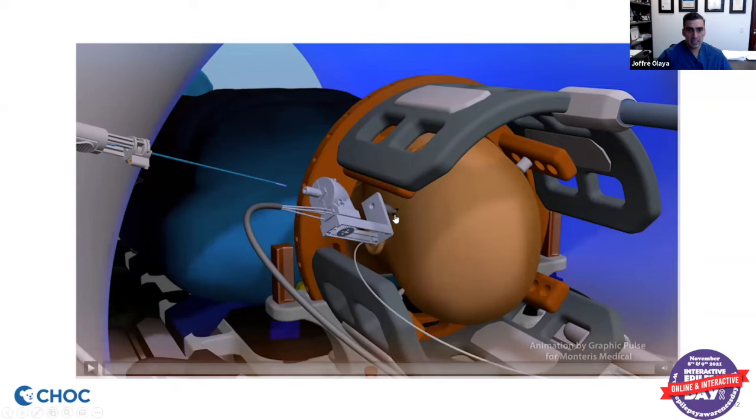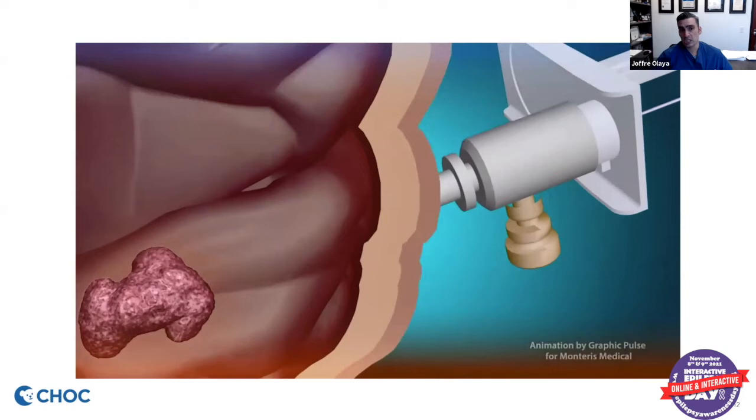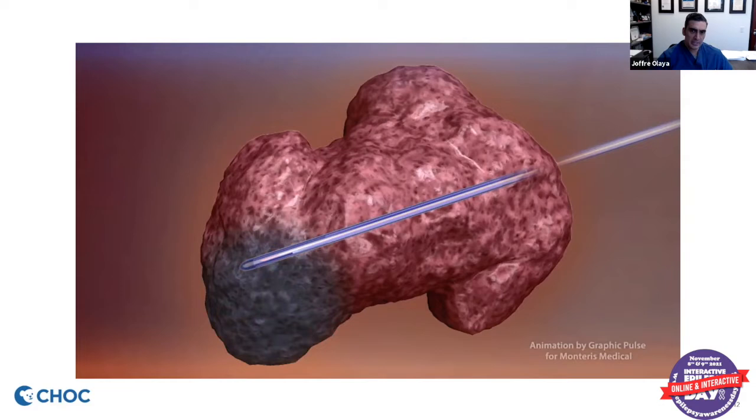So then this is the patient that has the bolt in place, then we have the attachment for the laser here, and this is the laser probe here. And then you can see here, as we insert it all the way down to the target. Again, this is after we figured out where the seizures are coming from. Then we can place the probe all the way down to target, and then we can heat up the tissue. Now there are different types and different sizes of probes, depending on what the lesion looks like and what we want to target.